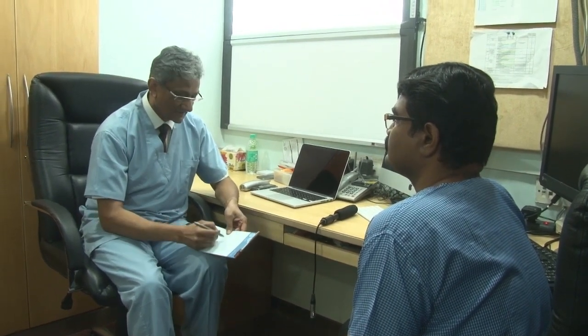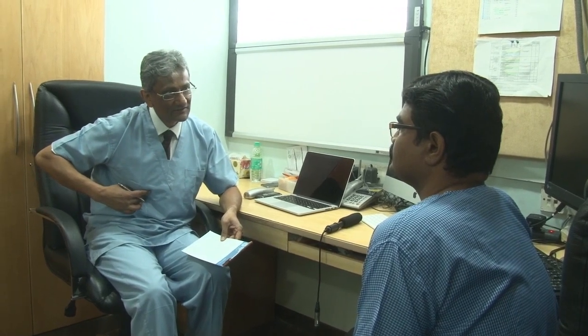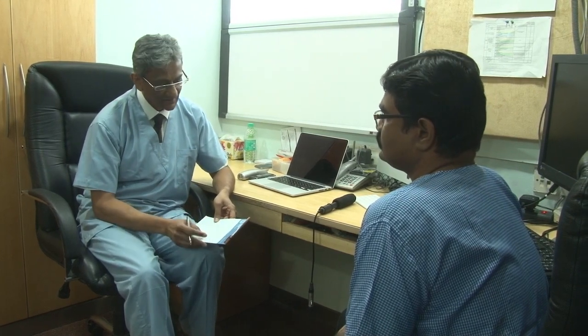Alright. So I need to explain to you what I'm going to be doing. You need to understand that. And if you have any questions, if you don't understand anything, feel free to ask. Yes, sir. The same goes for you all as well. Alright. So I'll be placing you straight on your back, the way the CT scan was done earlier. You know that you have something in the lungs on the right side, so I'm going to put a needle straight inside, and I will remove whatever comes out of it and send it for testing. I'll be doing this under local anesthesia.